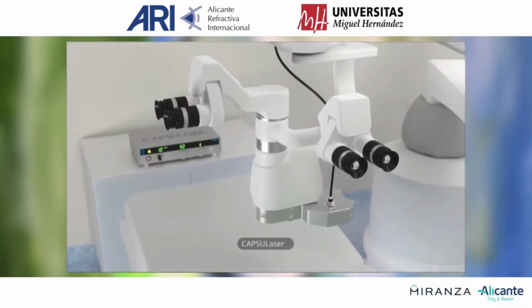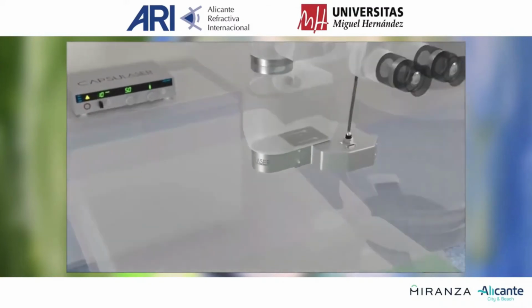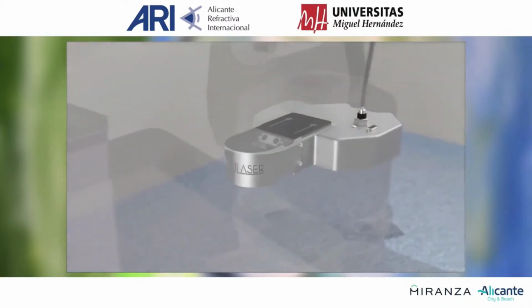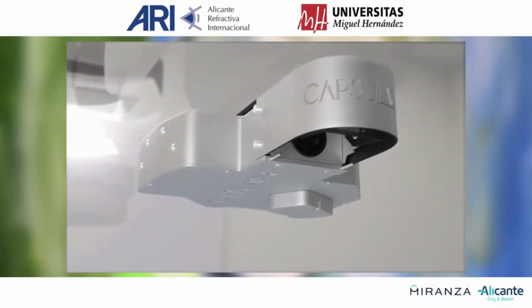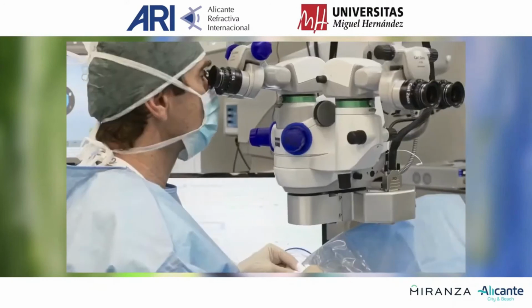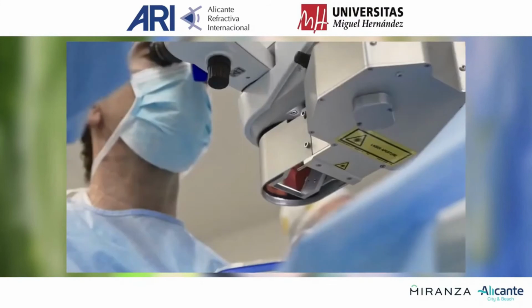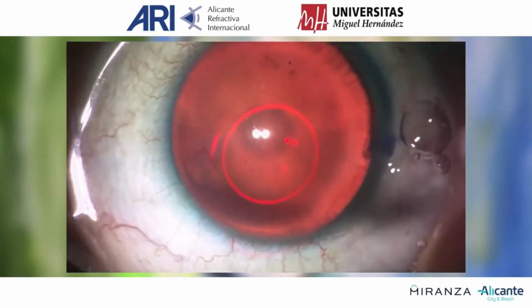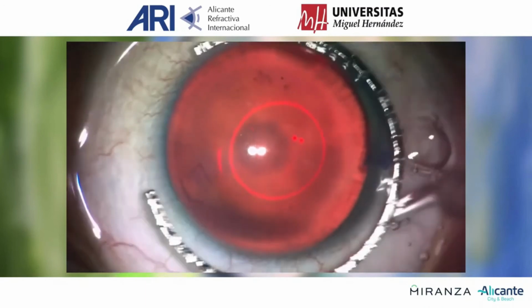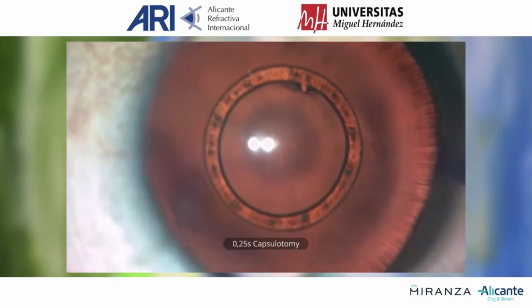CAPSULaser is a compact laser with a delivery system mounted under a microscope, which fits all different types of surgical microscopes. The laser performs capsulotomy in only 0.25 seconds, with a diameter from 4.0 to 5.5 millimeters in 0.1 millimeter increments. The contemporary version requires no surgical contact lens, which makes the procedure very straightforward. After the centration and focus, the circular capsulotomy is done.